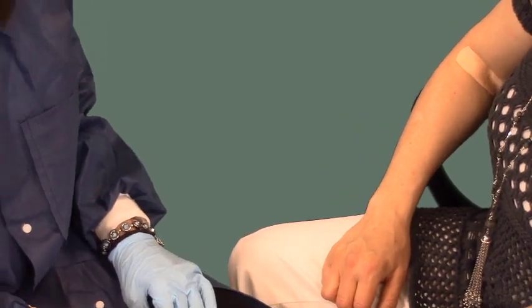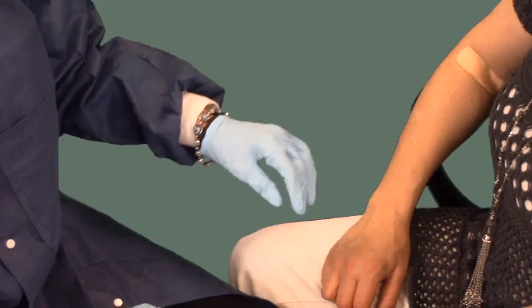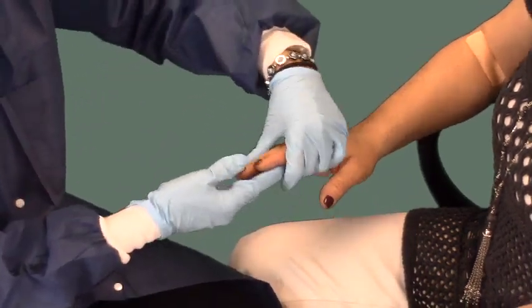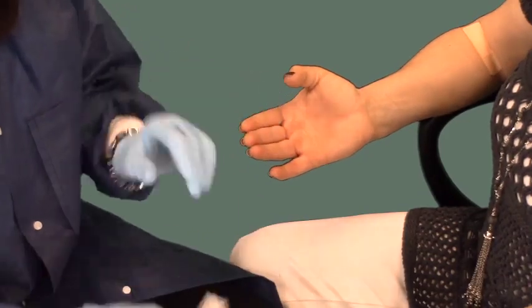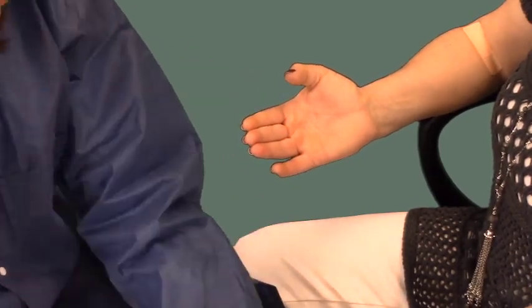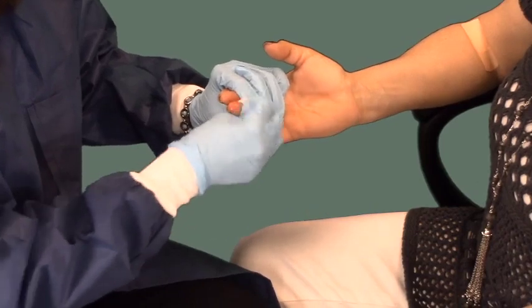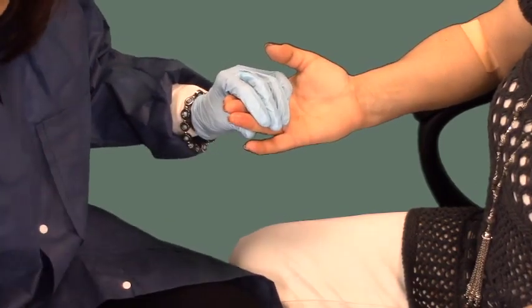With small children, ask them to clasp their hands together to avoid touching things until ready for the finger stick. The pinky side of the ring finger is a good choice for finger sticks. By holding the hand as shown, there is good management of the patient's hand and lower risk of infection as this is not a grabber finger.